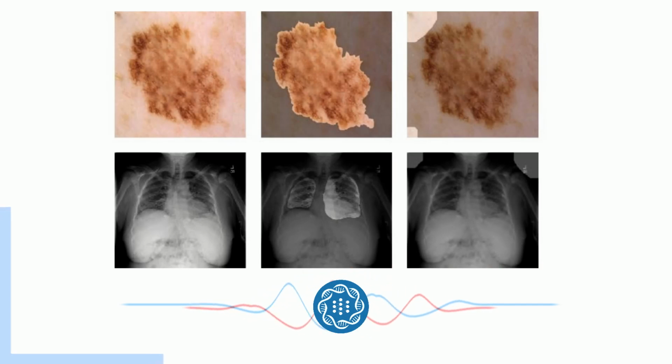But does it really work in the real world? I know there was that research paper we wanted to talk about that kind of put SegX to the test. Definitely. So what happened there? Well, they looked at SegX using two data sets, one for skin lesions and another one for chest x-rays. What they found was SegX consistently improved how accurate those XAI explanations were, and it really brought them more in line with what doctors would actually find important.